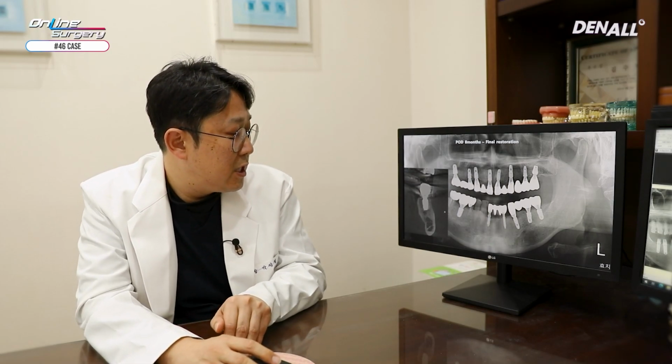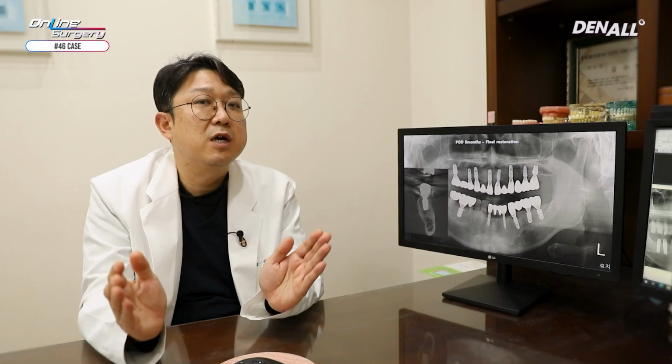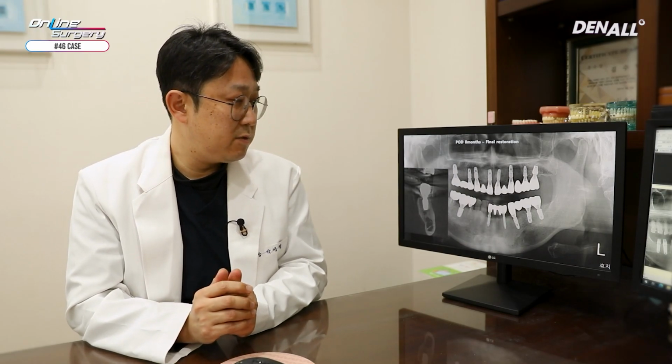In that case, I carefully consider the abutment cuff design that can be very soft tissue friendly. So if you place an implant deep, you need to consider that aspect carefully. And the treatment for this patient was completed.